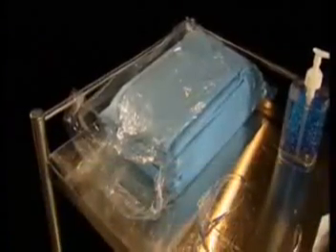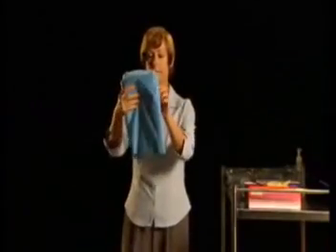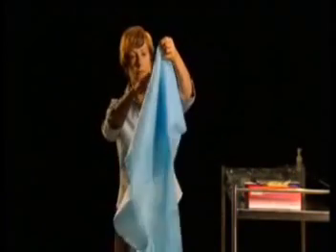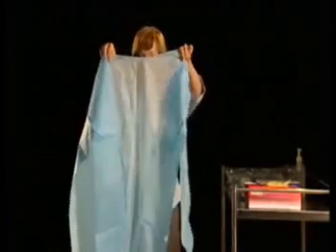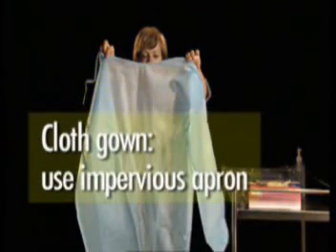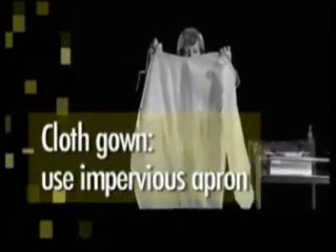Protective gowns will prevent your clothes from being contaminated. The gown should be impervious, long-sleeved with fitted cuffs, and able to effectively cover your clothing. When non-impervious gowns are used, such as cloth gowns, a disposable impervious apron should also be worn.